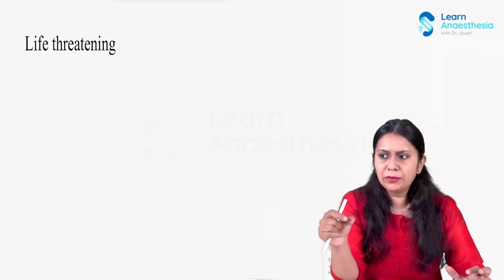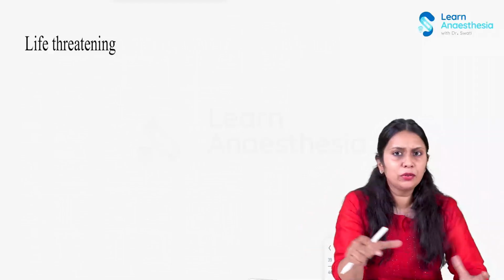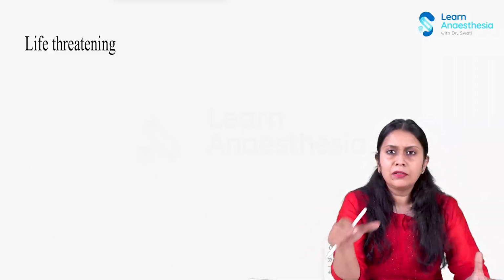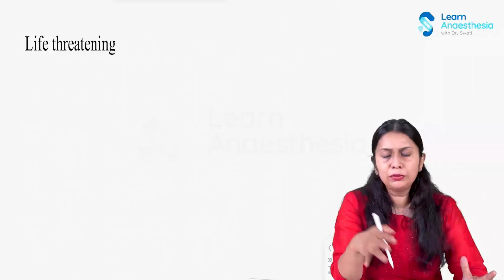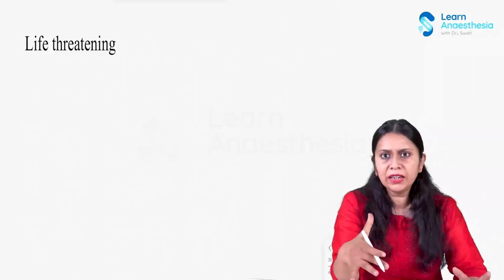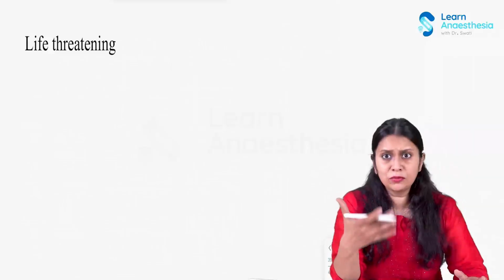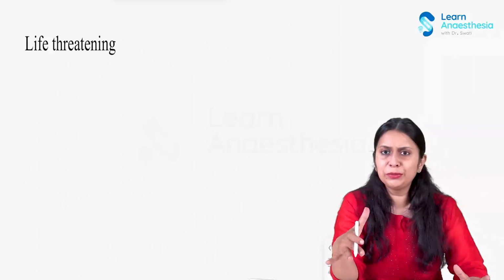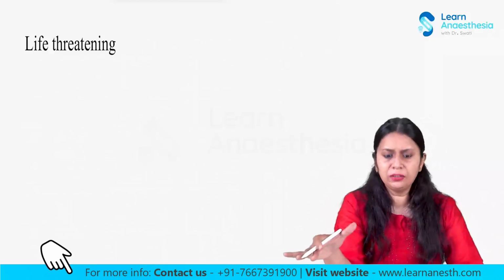If it is life-threatening, that is, a very high airway pressure being achieved and hypotension, immediately we have to disconnect the circuit, stop the ventilator, and disconnect the circuit for 15 to 20 seconds. Then we reconnect, and on reconnection, if the airway pressure is not shooting up as it was earlier, then definitely it was intrinsic PEEP. If the hypotension improved, the diagnosis is kind of confirmed.